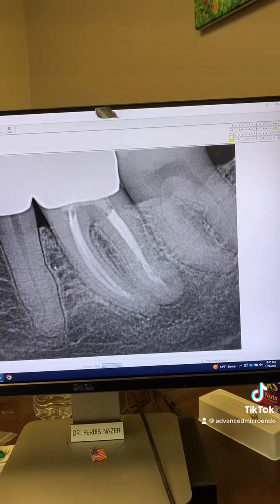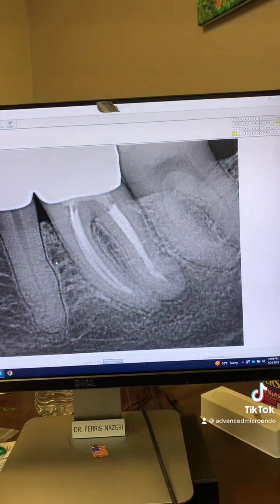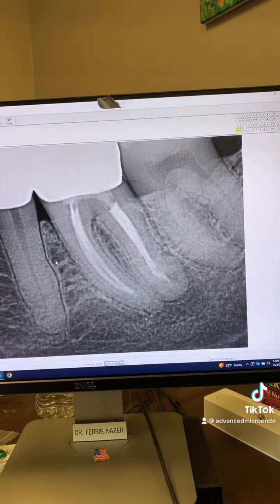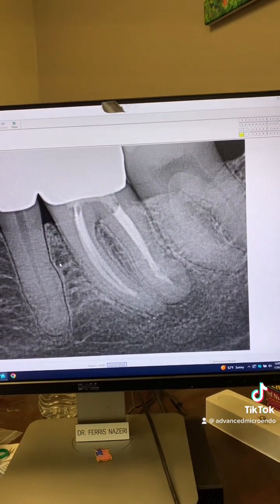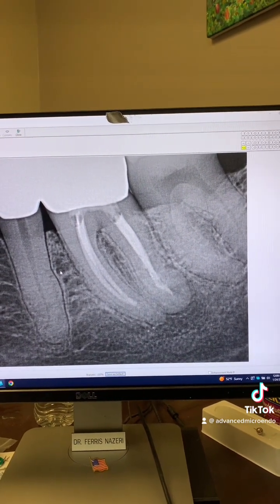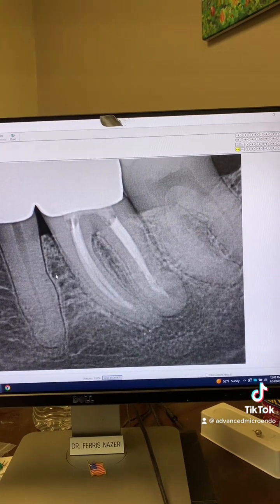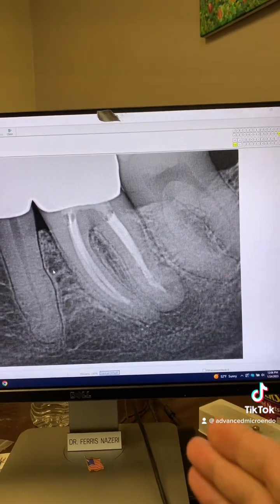Unfortunately, we had to go through this brand new porcelain crown that was done a year ago. We went through the porcelain crown, removed the buildup material, removed the gutta-percha. The working length of the mesial canals was 27.5 millimeters, which explains why this dentist instrumented and filled short — very likely they didn't have the 31 millimeter files. But that's no excuse for this kind of root canal. They should have recognized it and referred the patient to an endodontist.